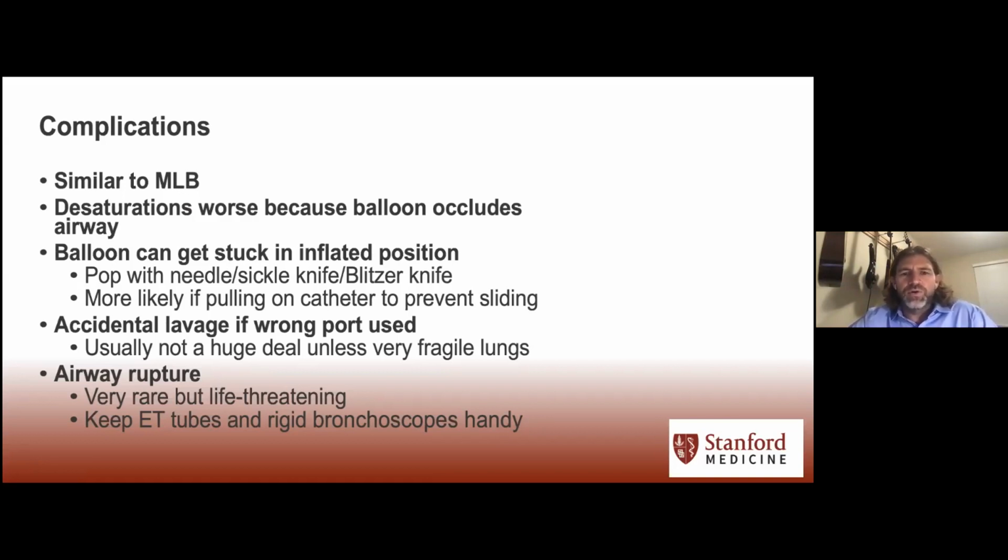The wrong port, if you put the saline down there, you will cause some problems if you have a patient with fragile lungs. Many of my patients would not tolerate a 15 cc lavage.